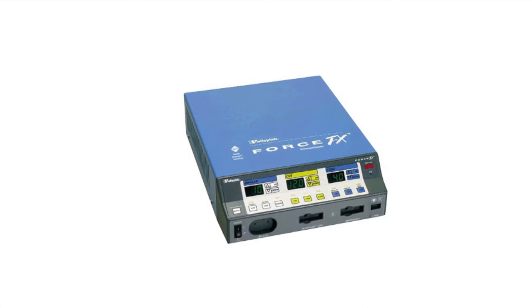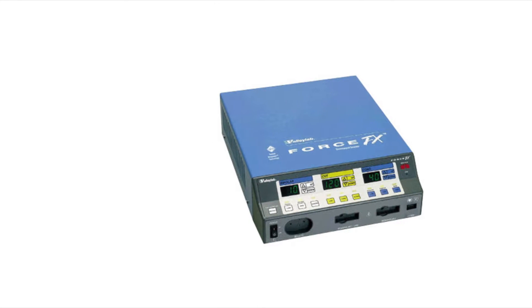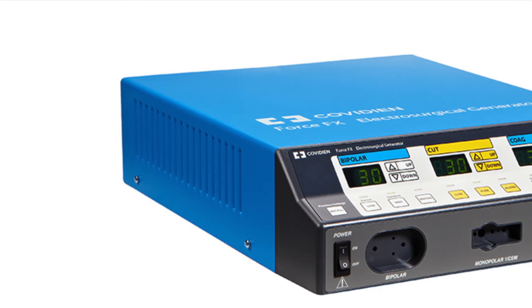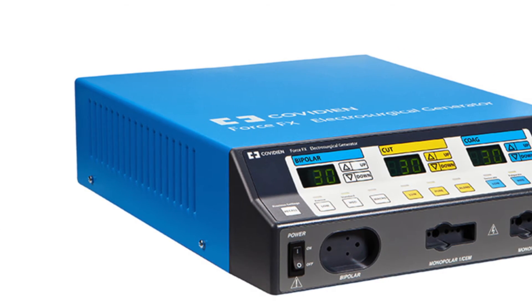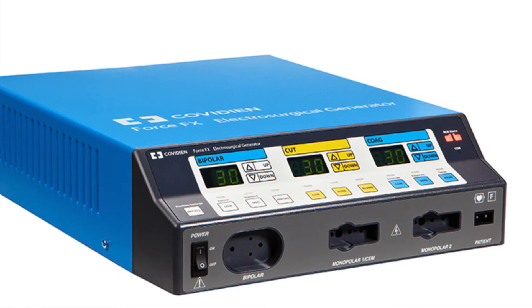The Force FX allows you to adjust the activation tone volume and reset the mode and power settings. The Valilab Force FX can be used in conjunction with the Valilab Force GSU system and the Valilab Electroshield monitor.